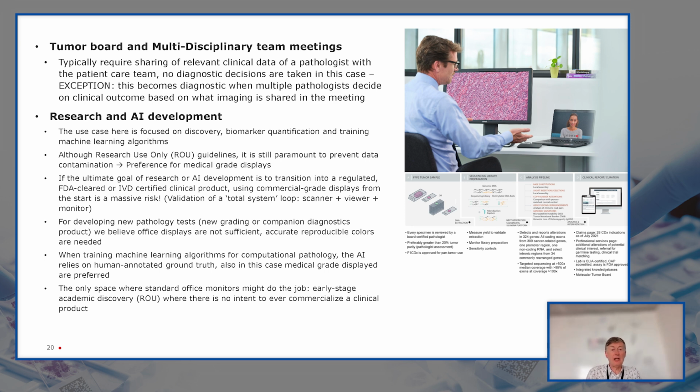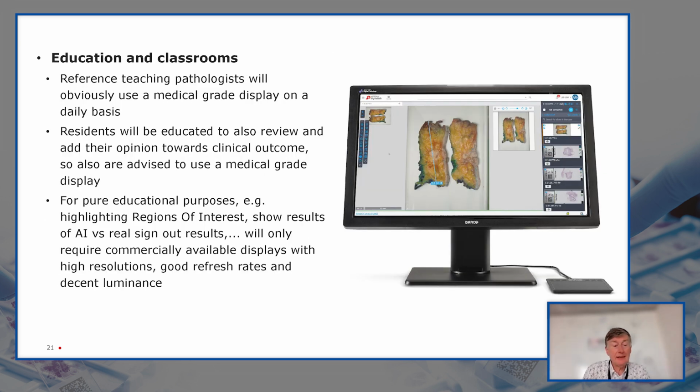If we look at education and classrooms, then I think you start from a teaching pathologist who's the lead. He will have a medical grade display, just like the resident, but for pure educational purposes, like highlighting a region of interest, that might not be important, and you might do the job there with a decent 4K office display.